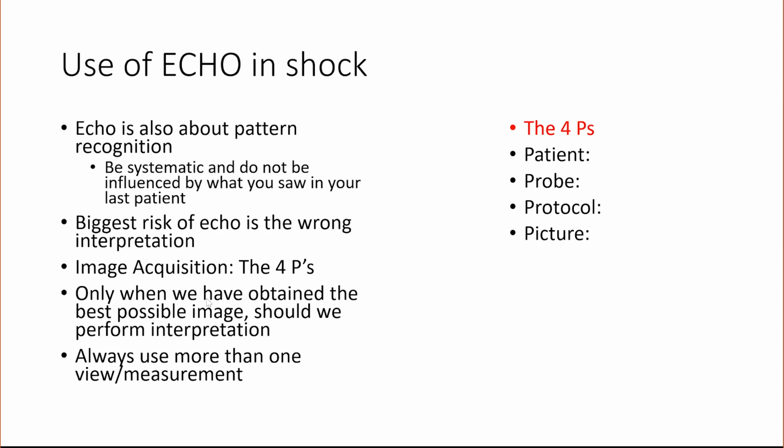Only when we have obtained the best possible image should we perform the interpretation. So avoid this natural inclination of trying to interpret at the same time you are scanning. Obtain the images, go back, do the measurements, and then interpret.